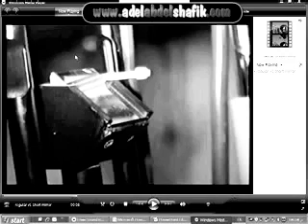Here you get 4 steps. Each step represents 5 degrees, and you can tilt the source of light, the whole bar containing the light source. This is important in case you are making a section in the macula and this section of light is horizontal and you want the light to come at an angle.